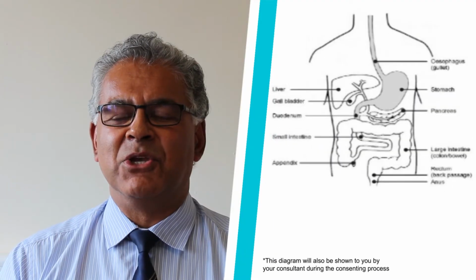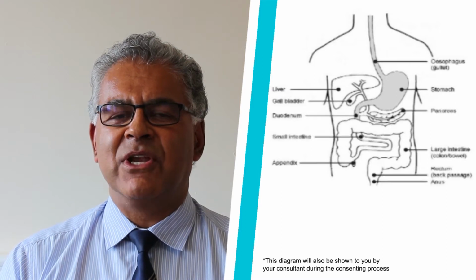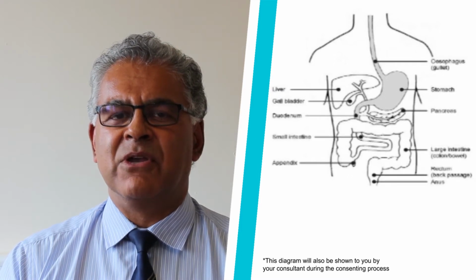What is colonic dilatation? Prior to the procedure, you will have had a CT scan or an MRI scan to delineate the stricture and show the position of this to the endoscopist. The endoscope is then passed into the rectum and to the level of the stricture. Thereafter, a balloon is used to open up the narrowing in the bowel. During this time, you will have had sedation and some pain relief to ensure that this is as comfortable as possible. X-rays are used during the procedure to ensure that the procedure is done safely and with a minimal complication risk.